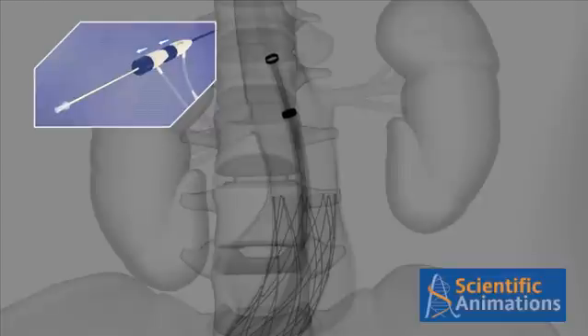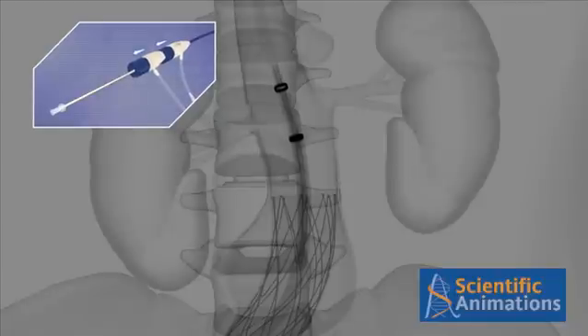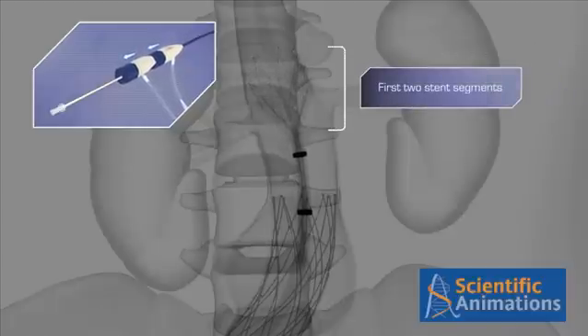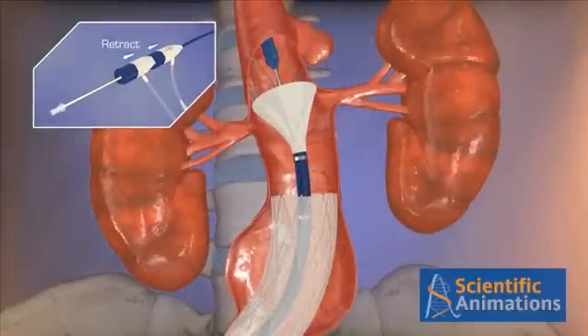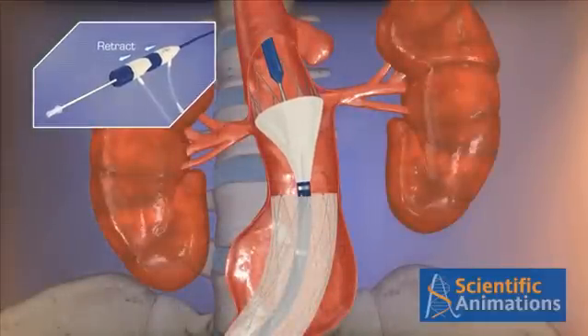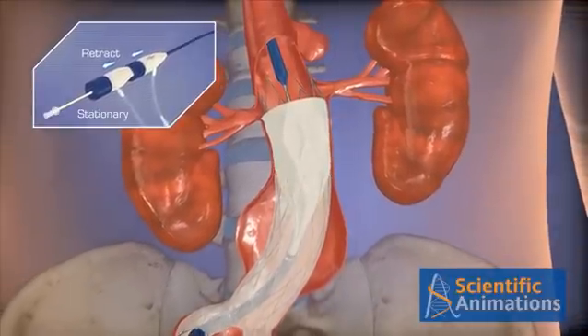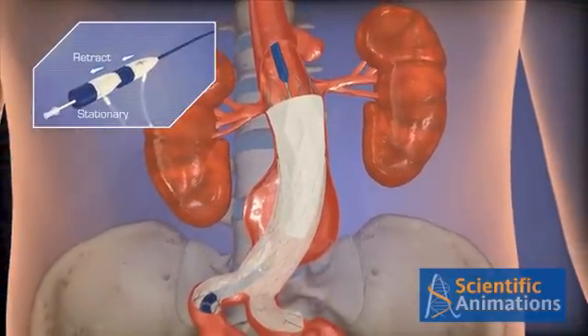Position the system under fluoro so that one covered stent segment is above the most distal renal artery. Pin the inner core and pull the retraction hub to deploy the first two stent segments. Position the covered stent graft just below the renal arteries, then pin the inner core and pull the retraction hub to complete the deployment.